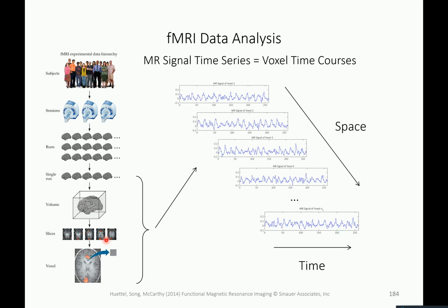Essentially how that works, which we will discuss in January, is that there's a link between how long you have the gradient on and which frequency you acquire. So it's all done in frequency space. For a very long time, you acquire the high frequencies. So you do a Fourier space frequency acquisition.